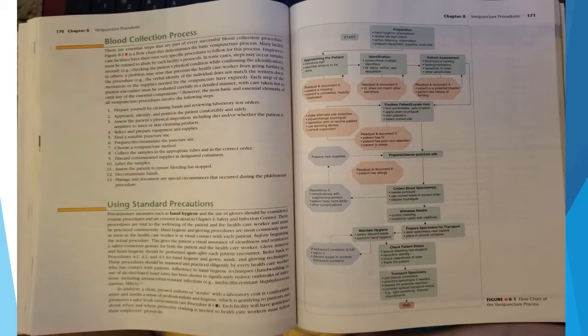In some cases, steps may occur simultaneously, such as checking the patient's physical condition while confirming the identification. In others, a problem may arise that prevents the healthcare worker from going further in the procedure, such as the verbal identity of the individual does not match the written documentation, or the supplies needed for the venipuncture have expired. Each step of the patient encounter must be evaluated carefully in a detailed manner, with care taken not to omit any of the essential components.